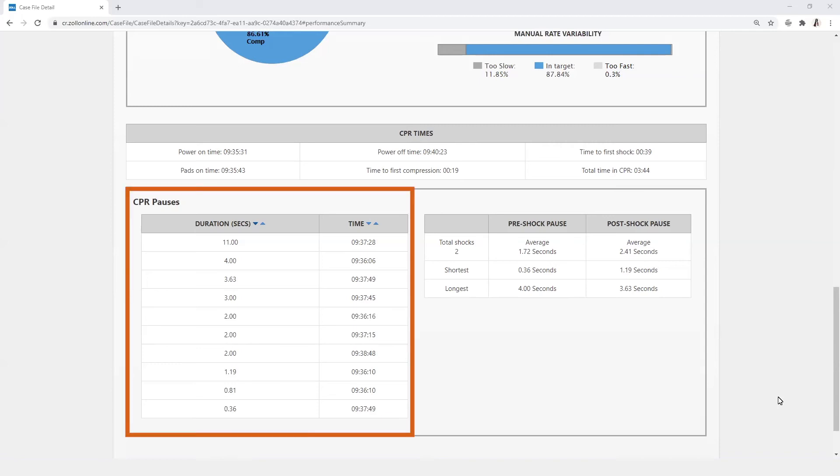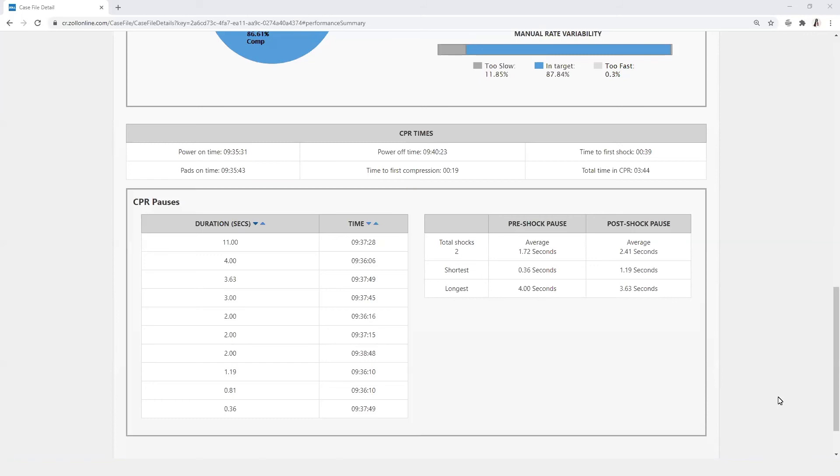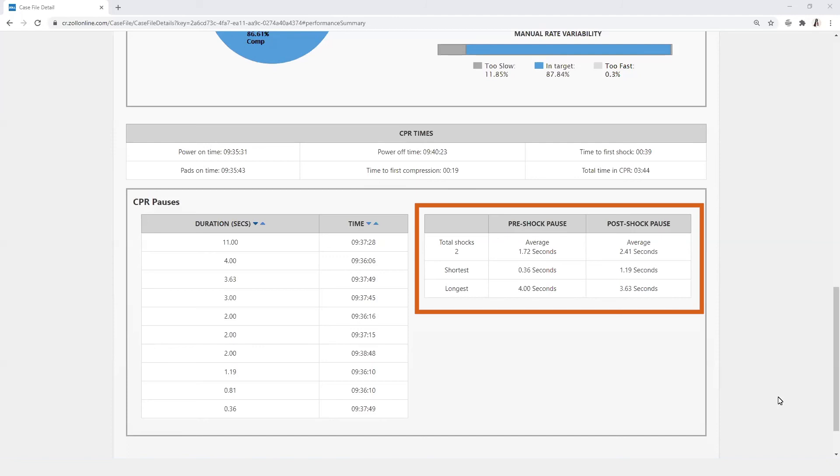CPR pauses are displayed by both the time they occurred and by their duration in seconds. The user can use the arrow to toggle the display to view those times from longest to shortest or vice versa. Pre and post shock pause times are displayed in the table to the right with the averages of both and the total number of shocks.